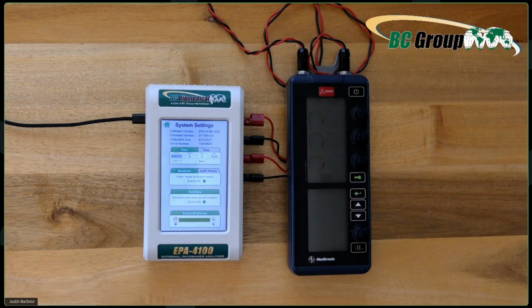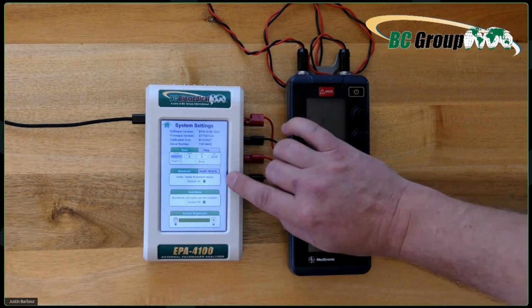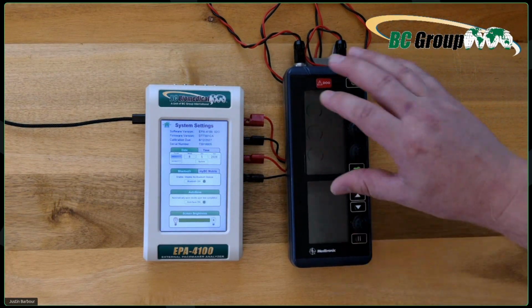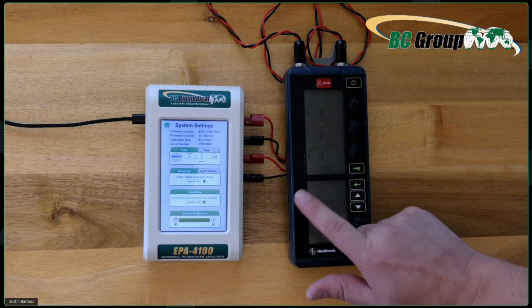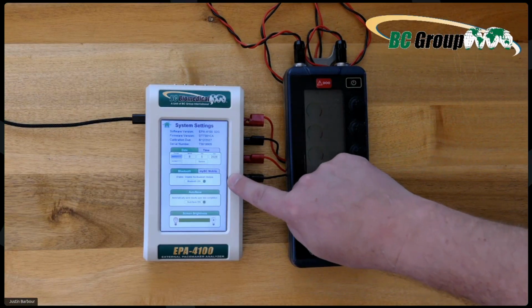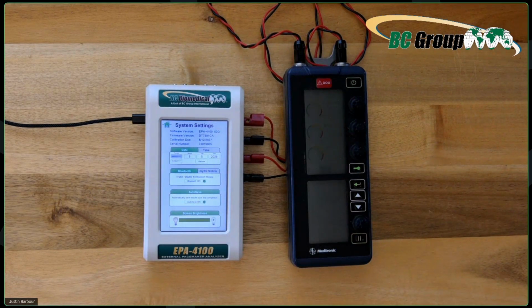Here is the settings. Very simple. We have date and time. We've got Bluetooth. Guys, this is going to be a pretty cool thing. With MyBC Connect, what we can do is with MyBC mobile app, we can create a template for, let's say, this Medtronic here. And it will walk you step by step through the PM process using Bluetooth, and it configures all these menus. You won't even have to touch the buttons. It will just walk you through it.